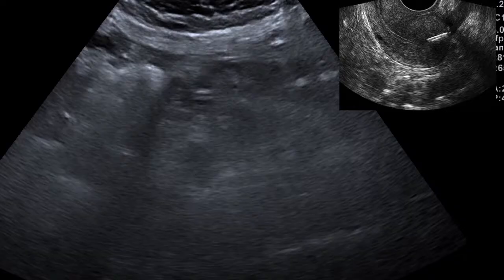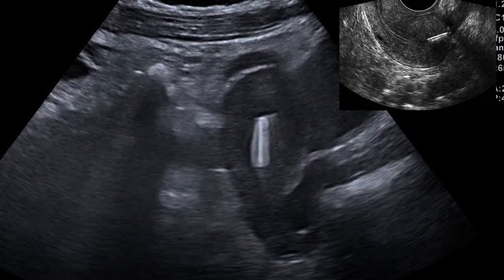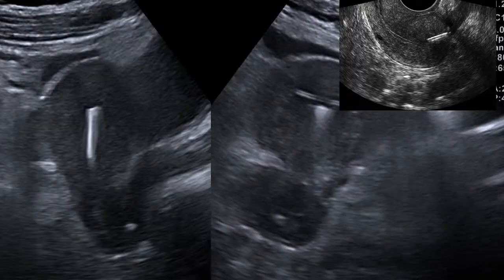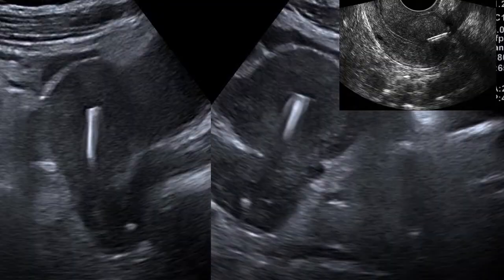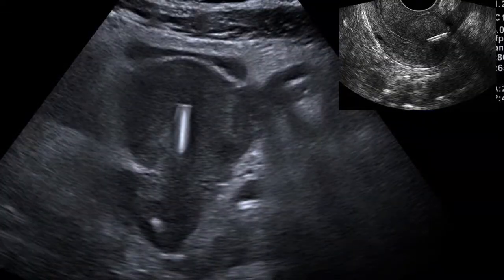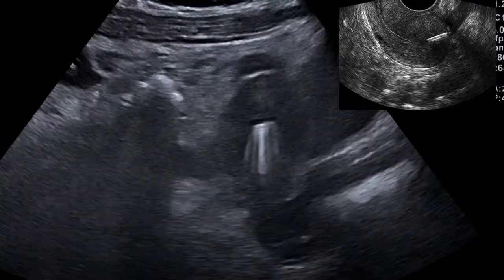So in general, we should not always blame things. You must also look at the merits of certain things. The IUCD is one of the safest long-acting reversible contraceptive methods. If it is correctly positioned, like in this case, it rarely causes severe pain after the initial insertion period. Persistent pain usually suggests another pelvic pathology. So if you see that there's persistent pain, it could be something else.